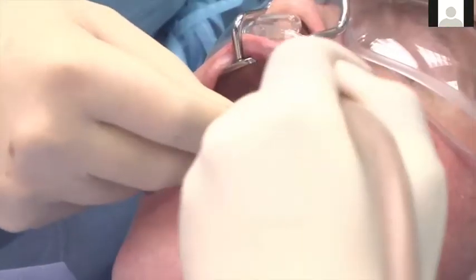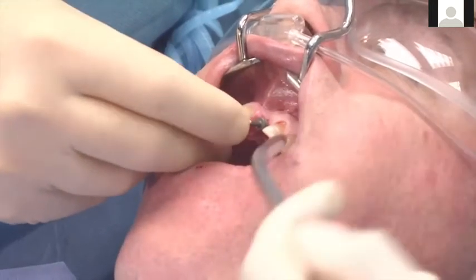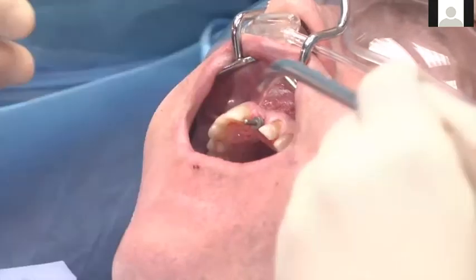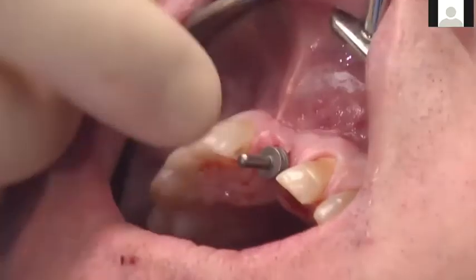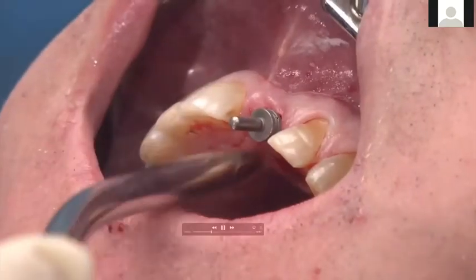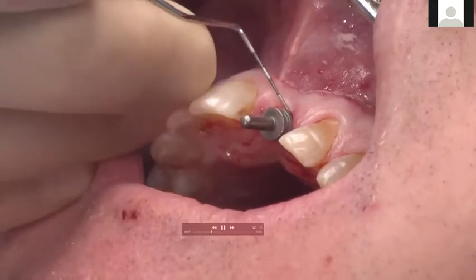But at this stage, it's important in anterior cases to do a measurement. You can see here we have planned everything, obviously, in the CT scan, how deep to place the implant, but a lot of times, especially in anterior cases, you have to make some modifications. You can see here our punch goes all the way up to here, right there where the probe is.